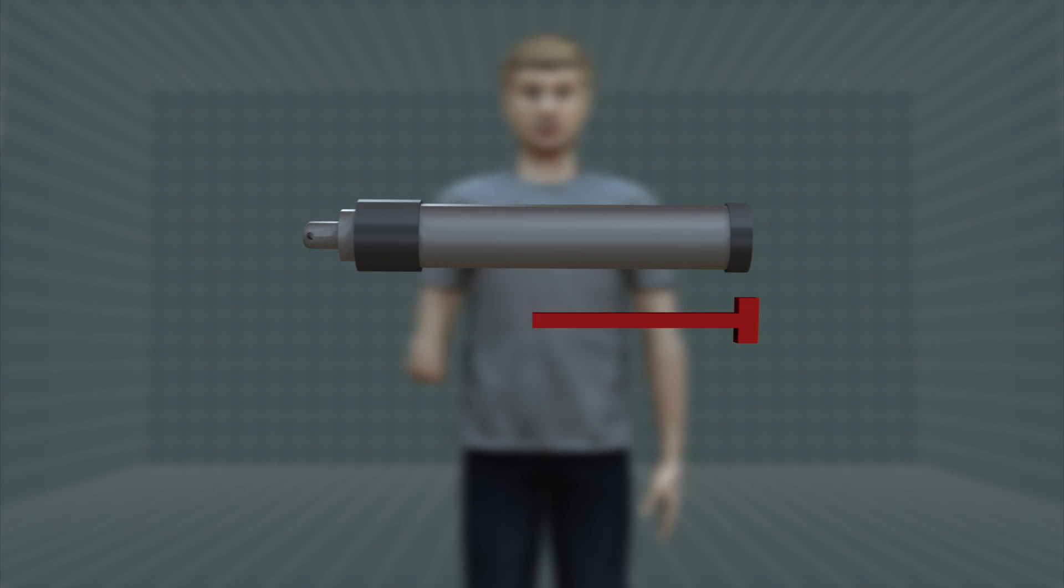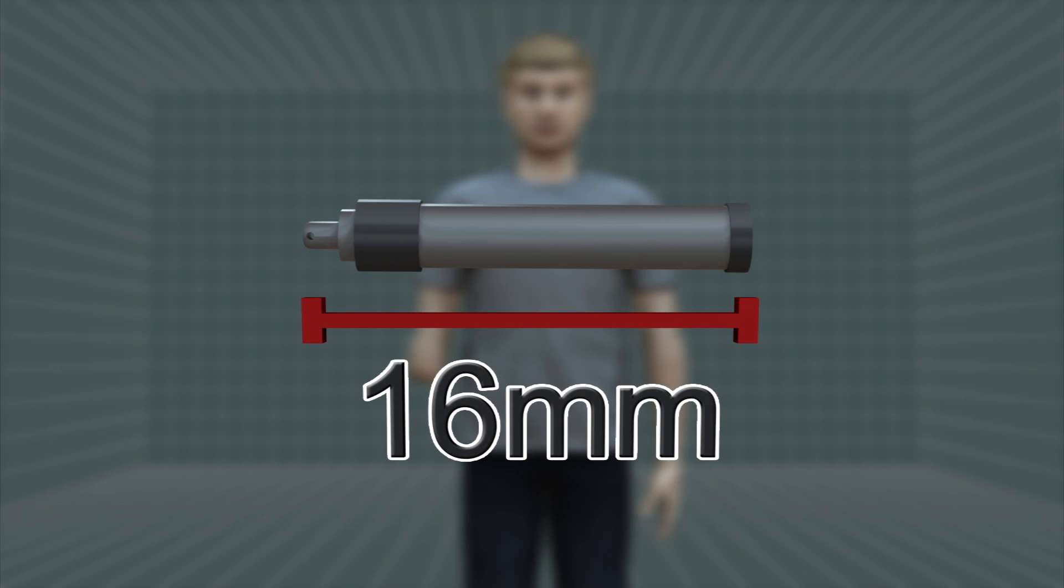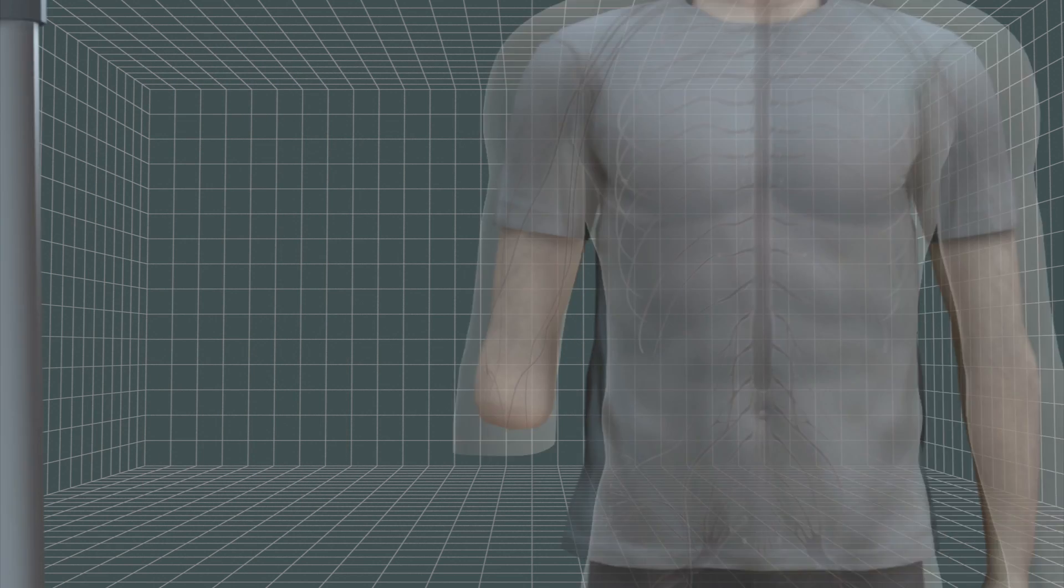Tiny wireless sensors about 16mm long are embedded directly into the residual muscles of the amputee's limb.